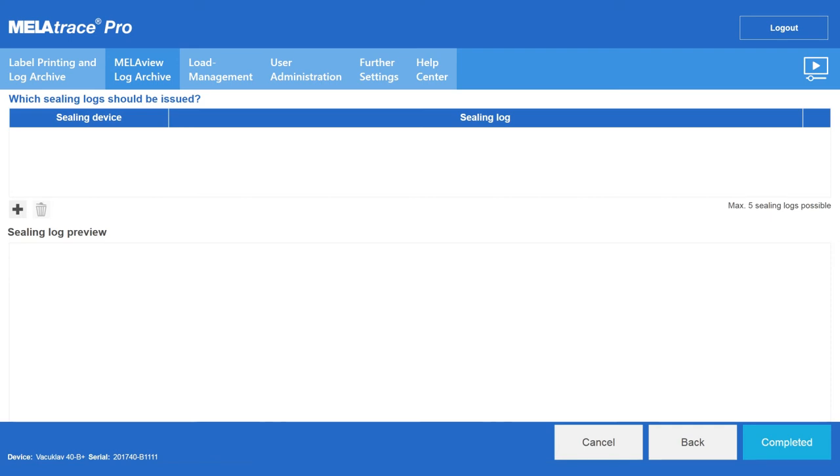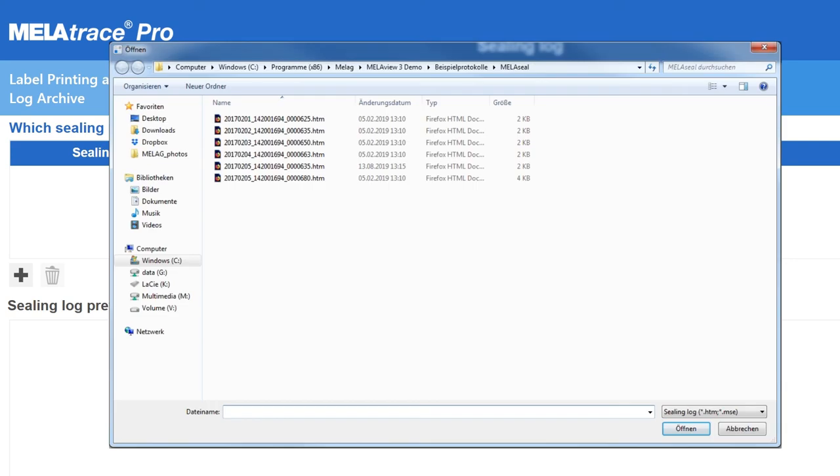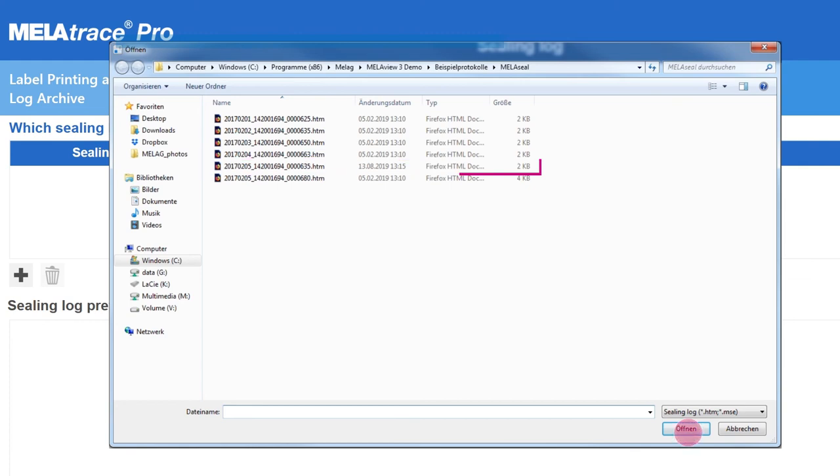To assign logs of a licensed sealing device, please click on the plus symbol. Now you can select the corresponding log file and click on Open.